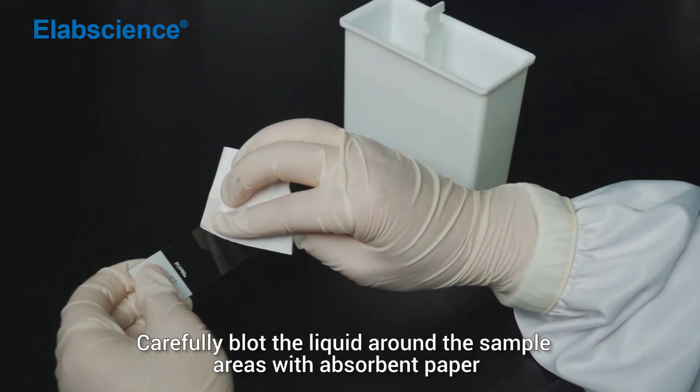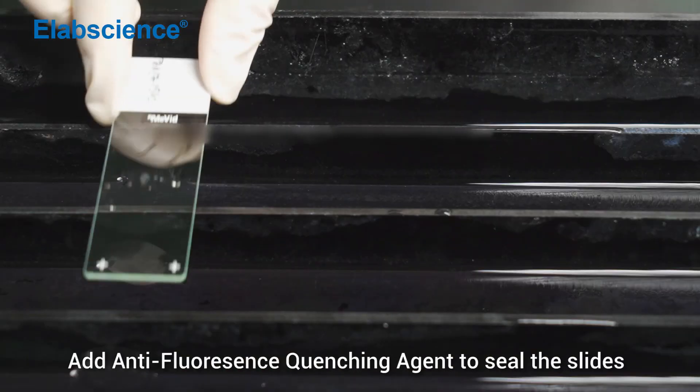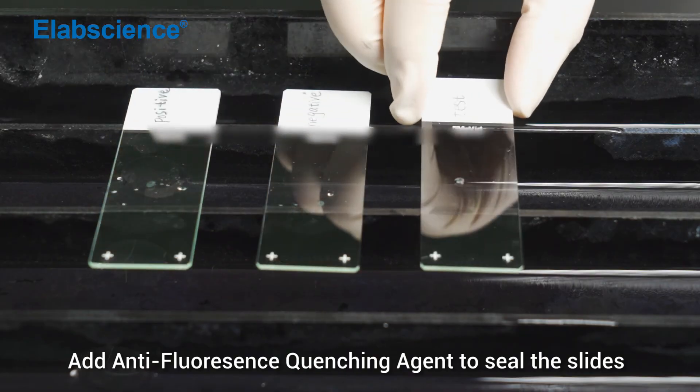Carefully blot the liquid around the sample areas with absorbent paper. Add antifluorescent quenching agent to seal the slide.